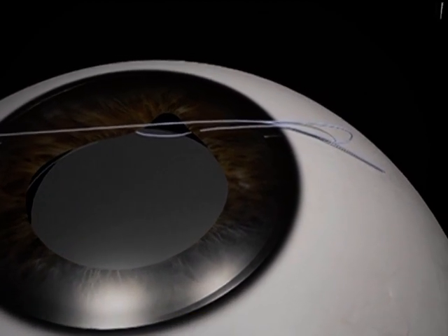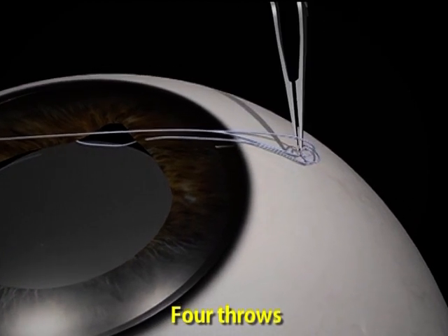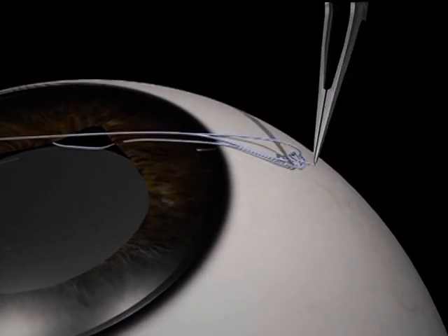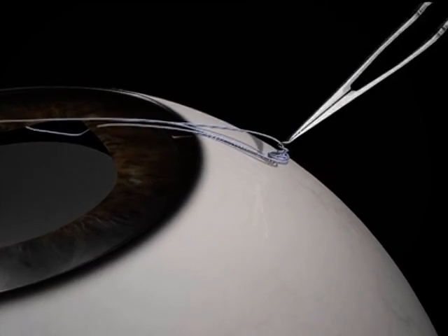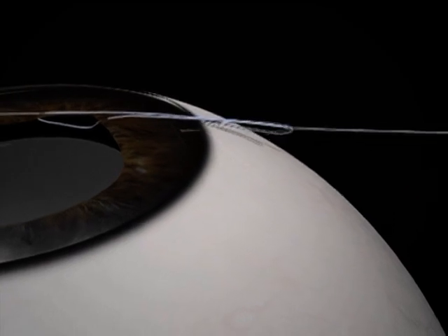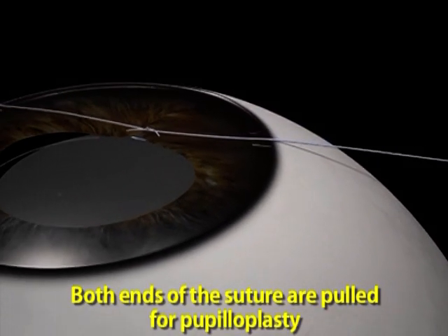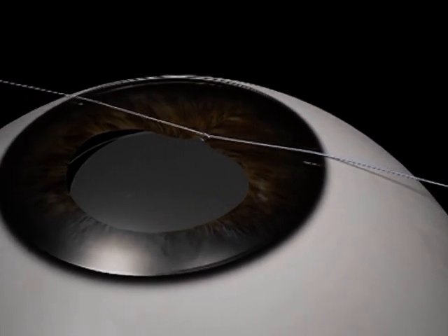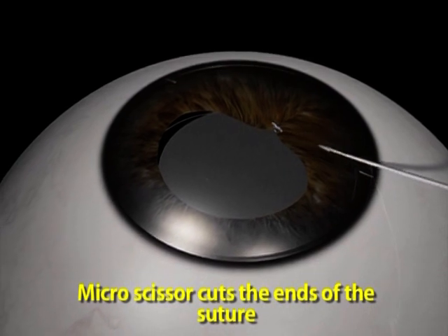Once this loop is made, now pass 4 throws — remember, 4 throws. Once you have 4 throws, you have one thread on one end, and the other is on the side of the clear corneal incision where you have made. Now pull both together, and once you have done that, you can cut that with a micro scissor.